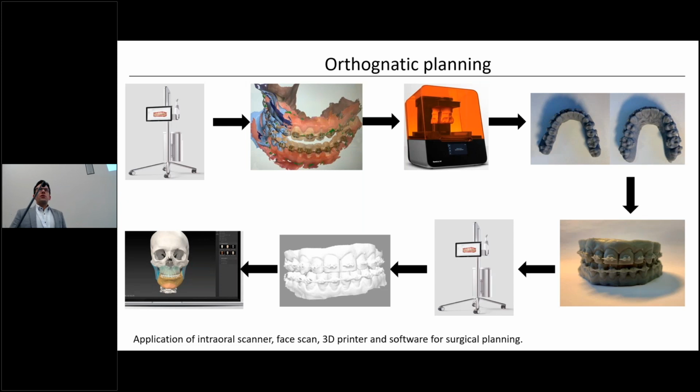We already heard some things about dental. Being an oromaxillofacial surgeon, also in the field of implant dentistry, orthognathic surgery, and aesthetic surgery, we're very familiar with intraoral scanning, with planning crowns and all that stuff. So we also use these tools, also a small 3D printer. We have this in our private practice because it's fast. You print it and in 1.5 hours, you've got the item in your hand.